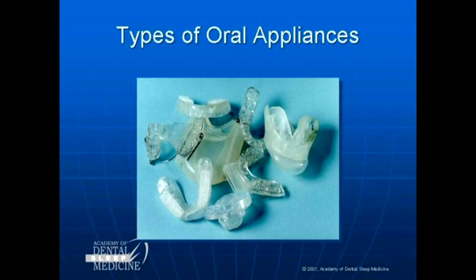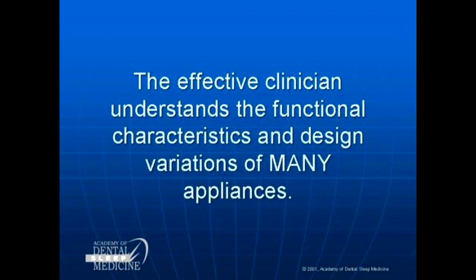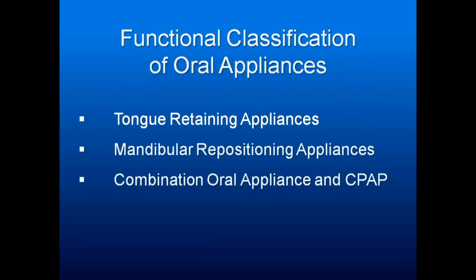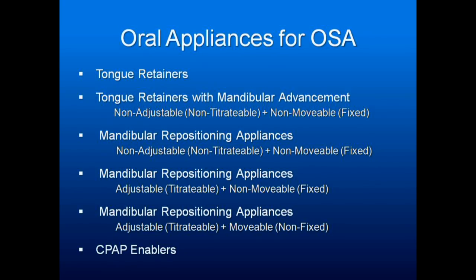Types of appliances. We need to understand lots of appliances. Don't get focused down on one. How they work, what they're made of, all sorts of variations. The functional classification of all appliances: you have tongue-retaining devices that pull the tongue forward. You have mandibular repositioning appliances that pull the jaw forward and pull the tongue forward and activate the pharyngeal muscles. And you have a combination of oral appliances and CPAP.